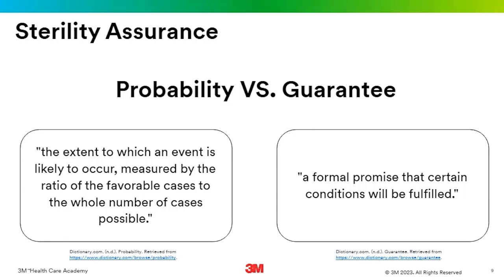What are we doing to make this declaration that, yes, we are confident that 99.9999% of the time, or there's a 99.9999% chance that there is complete sterility and destruction of all microbial life, including spores inside this set. And that's because we're working underneath the concept of probability. Okay, SAL, log reduction, whenever we're meeting terms and guidelines necessary to achieve sterility, we are working with probability.